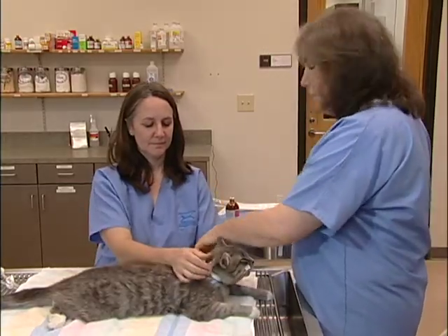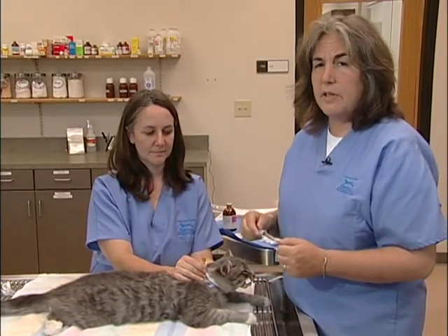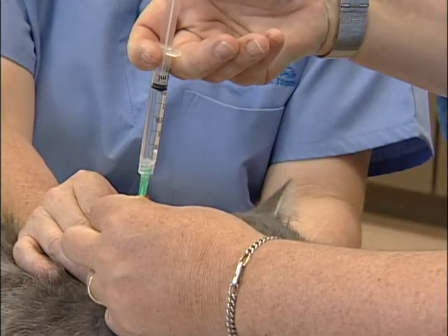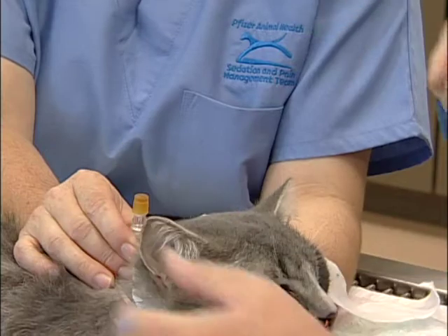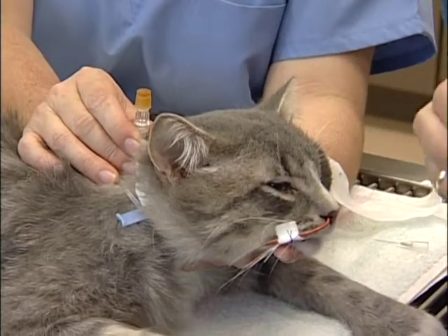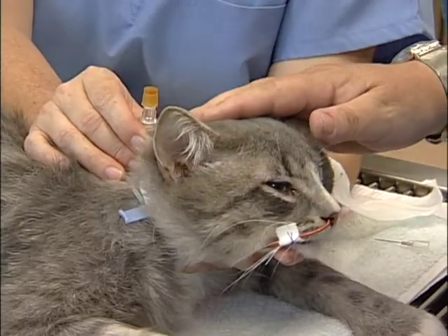Once I have that secure, I'm going to perform a test to ensure that we're actually in the cat's stomach and not in the cat's lungs. For that, I'm going to use sterile water just in case we're in the wrong location, and I'm going to inject about 3 cc's of sterile water into that tube. What we're listening for is to confirm that the cat does not make any kind of coughing sounds at all — and that looks good. When this cat wakes up later on, we can begin feeding a liquid diet, making sure to flush this tube with about 3 cc's of plain water every time we do a feeding.